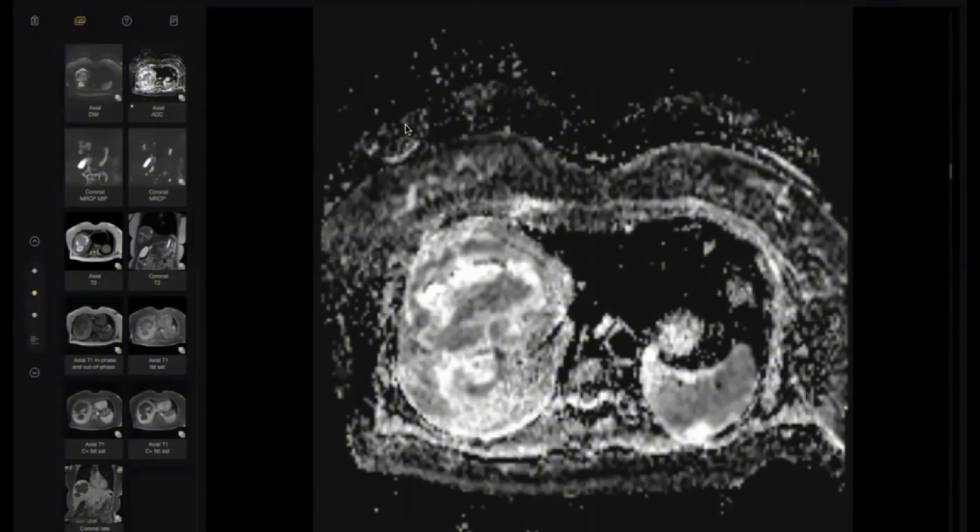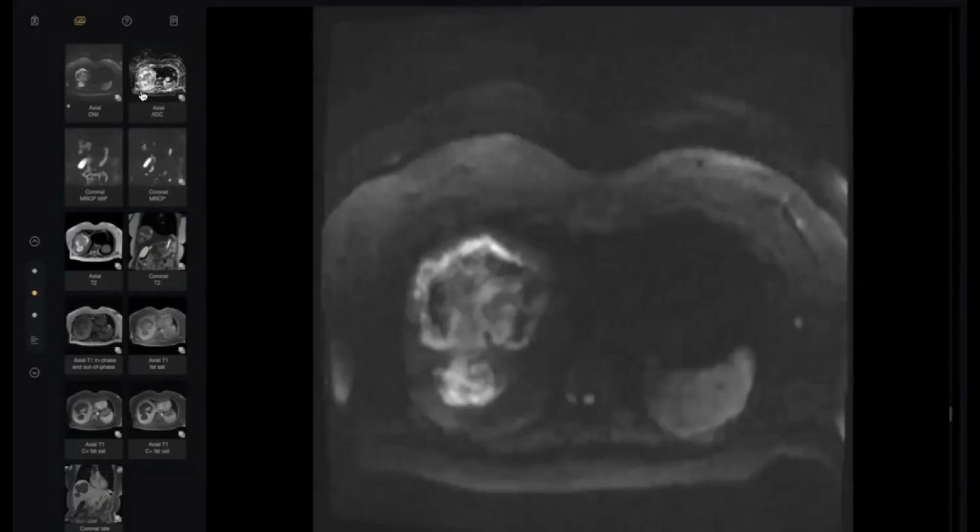Doctor, do you remember my history? Yes, abdominal pain and fever. Because of the constitutional symptoms of fever, the restrictive pattern and the fluid, this is the second time you forget the history and give a very far diagnosis. Take care. What's your diagnosis?